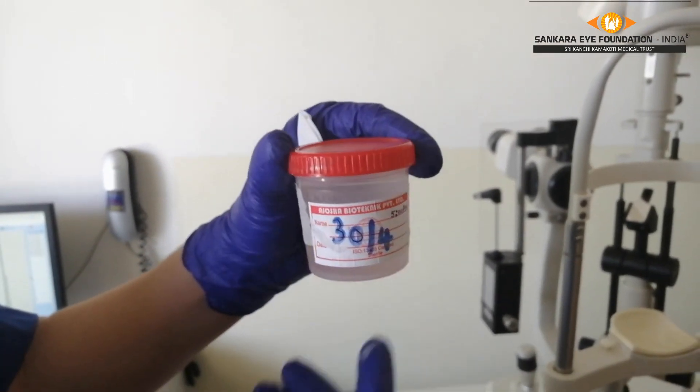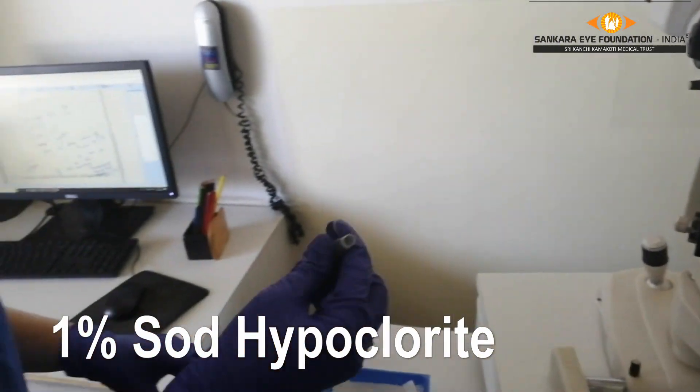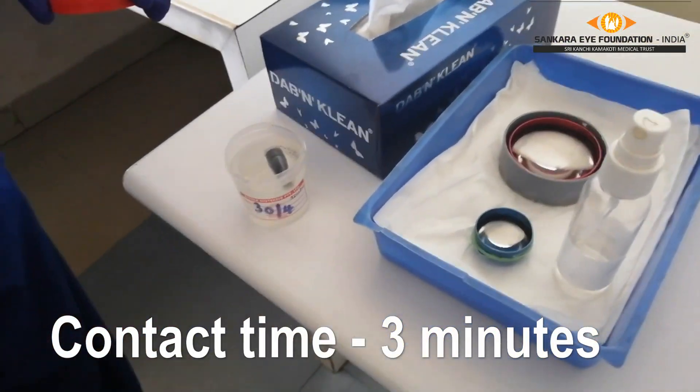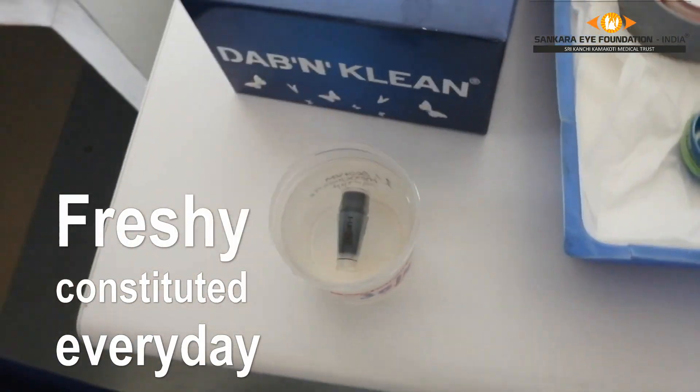Finally, after the Goldmann applanation tonometer use is finished for the day, it is put in a 1% sodium hypochlorite solution for a contact time of 3 minutes. This solution of sodium hypochlorite has to be replaced every day, as its effectivity lasts for 24 hours.